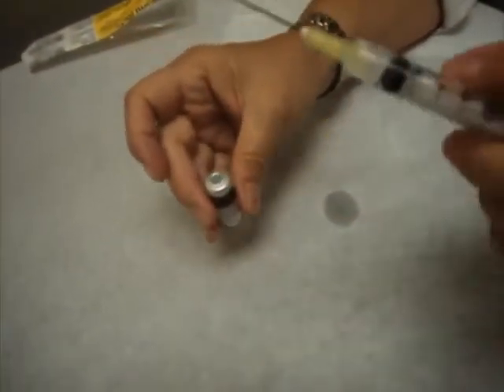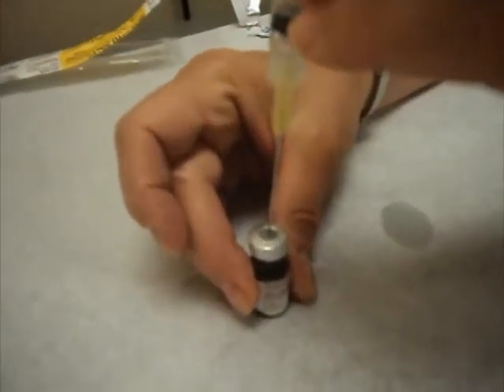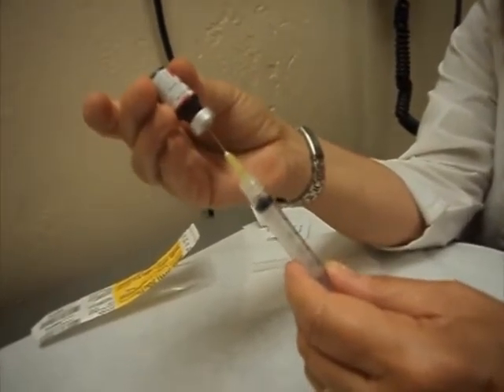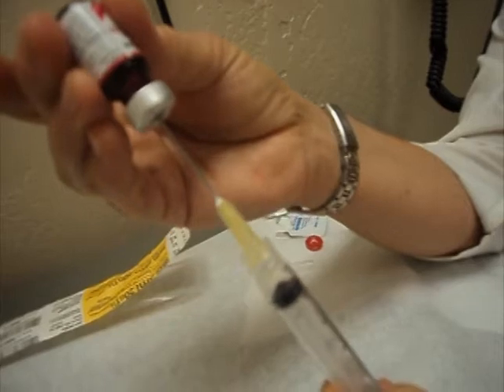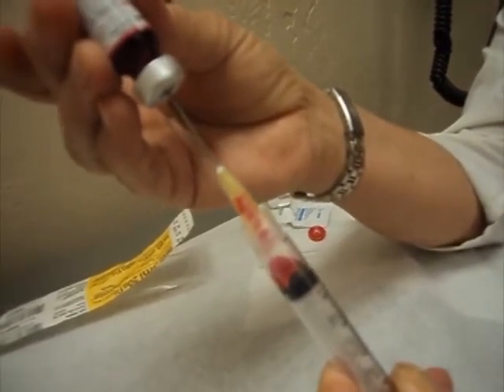The air is injected into the bottle, and the simple way to do this is just hold the bottle on a surface, put the needle in, and push the air in. The harder part comes when you put this upside down to draw out the medication. And in the small 1-dose vials, you need to be very careful to withdraw the needle till you can see it at the bottom of the vial. This assures that you are under the medication.